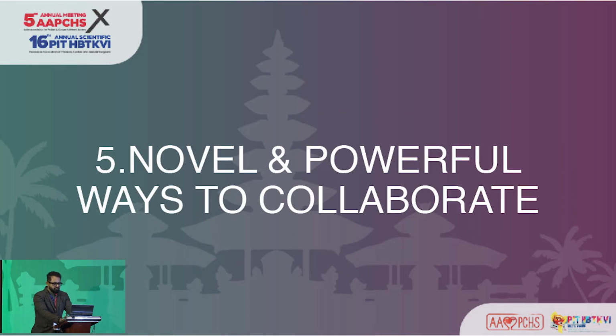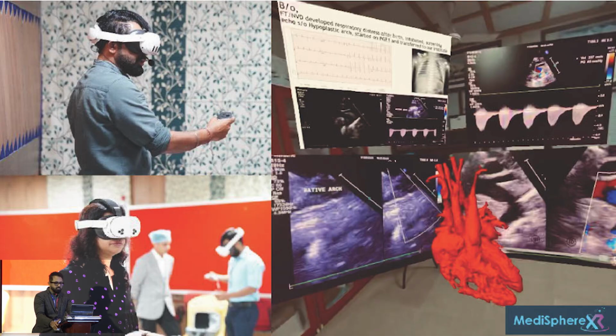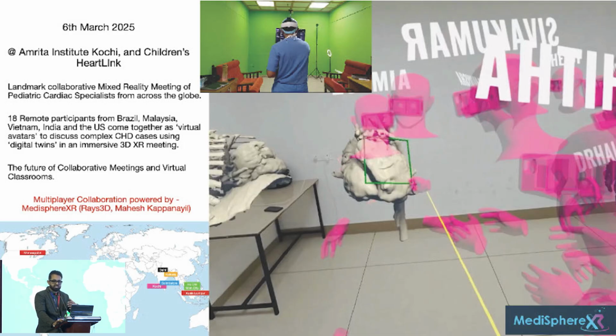Another very, very powerful and useful way of using VR has been to create instruments of collaboration. We have recently built this platform where we can bring the surgical 3D models into a VR space. You can also pull up various imaging data, including the CT scans or the X-rays and echoes, and we can view it in VR, not only by oneself, but you can have multiple people join these sessions from anywhere in the world. Many different countries across the world are participating together as virtual avatars, and we're discussing the planning of a complex surgical case together. And this is the first time that something like this has ever been achieved.